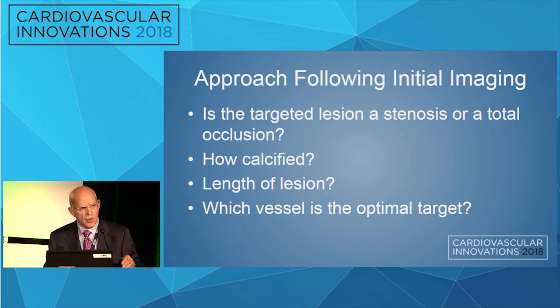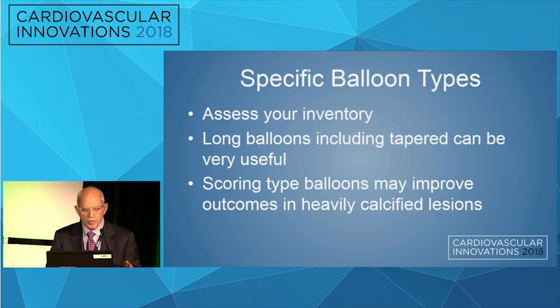You heard about angiosomes. People have used that. Quite honestly, I've gotten to a point now, pragmatically, where I look at the vessel that I think is going to be the easiest to fix and that will provide the best perfusion to the foot. The angiosome concept is a nice one theoretically, but from a practical standpoint, go for the meatiest artery that you can open that will improve blood flow.